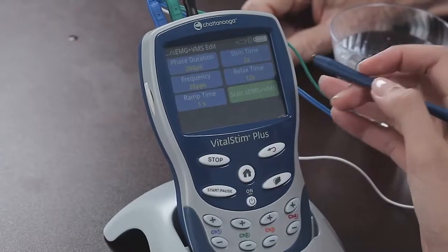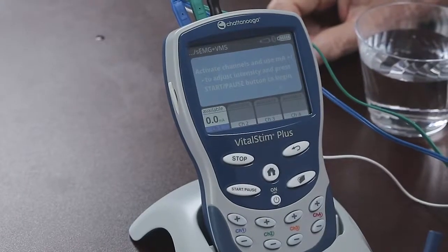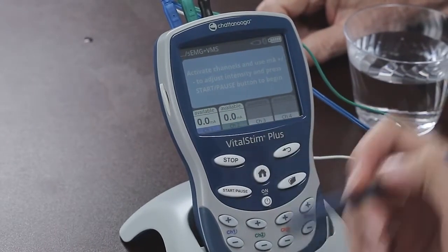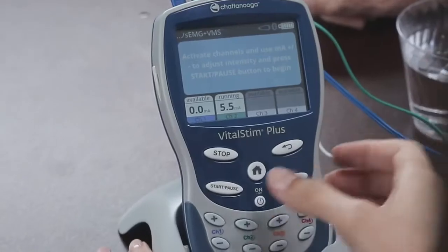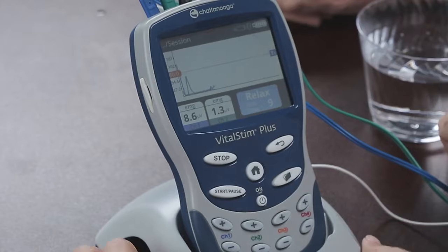Press the Start Surface EMG plus VMS button and we bring up this screen. Channel 1 is already active and it will remain active because it is the triggering channel. But in this example, we are not going to stimulate through it, so we'll leave the intensity at 0 milliamperes. We select channel 2 in order to increase the therapeutic intensity. Let's do this for this patient as we have done before. And once we are at the right level, press Start, Pause, and the machine will start in relax mode.